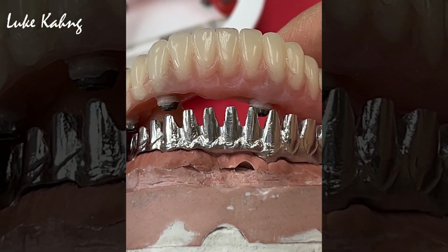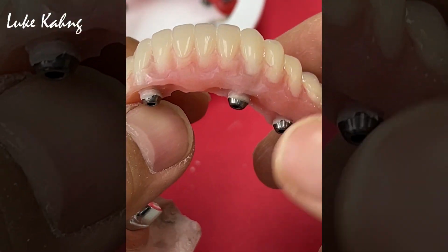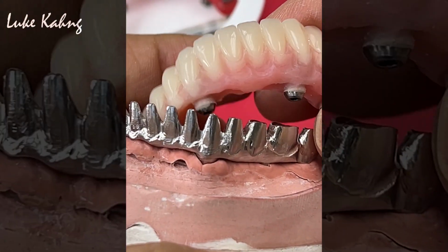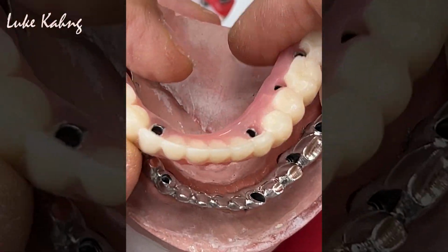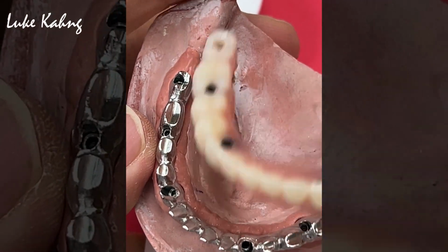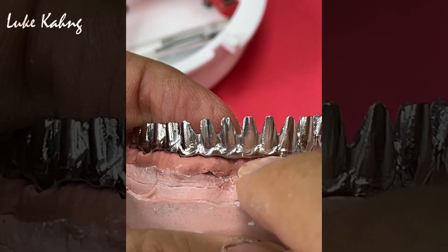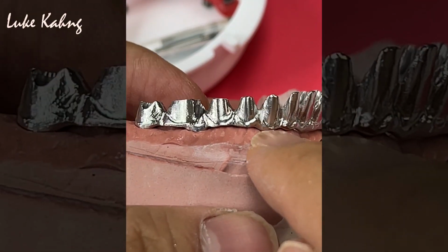So you saw the overall design, and this is the prototype, but after I grind, I stop it. You see, it's slim, and here's more thick. The computer design is really good, so it makes it really thin in between the posterior teeth, right? And then we'll make this really slim, especially the lingual, okay? And also minimize the pink porcelain. Predictable design.